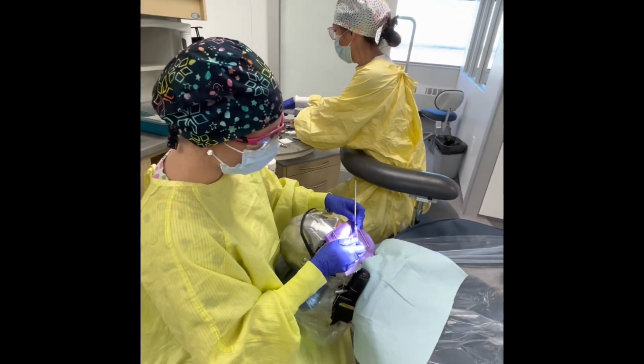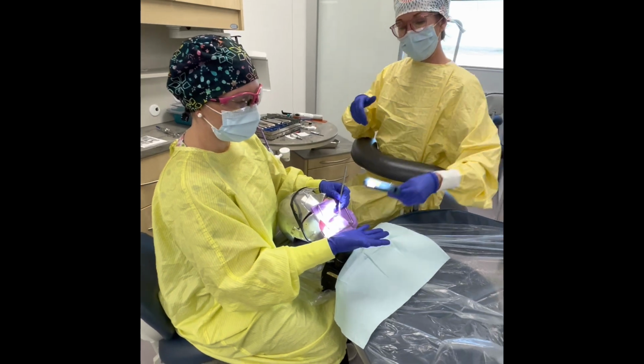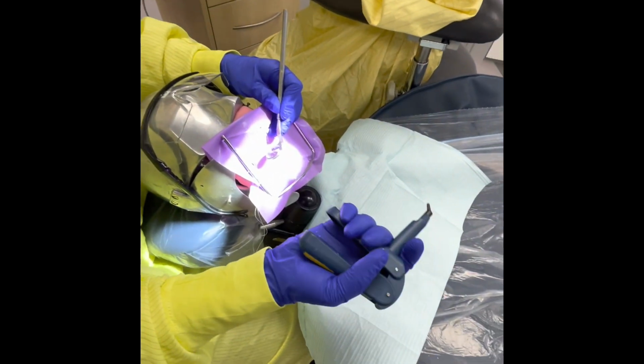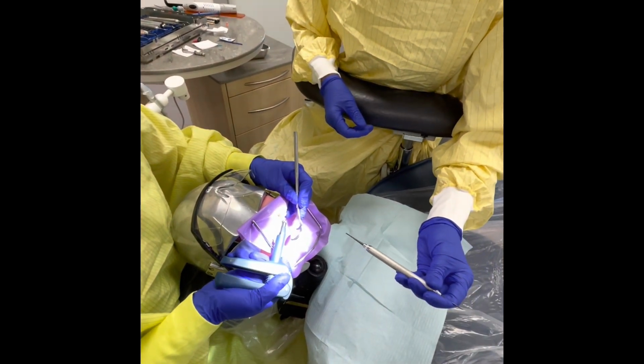So that has been cured. The next step that we're going to do is place the composite. So Stacy's going to pass me the composite dispenser in my palm like she just did there. I will take and squeeze it into my preparation.